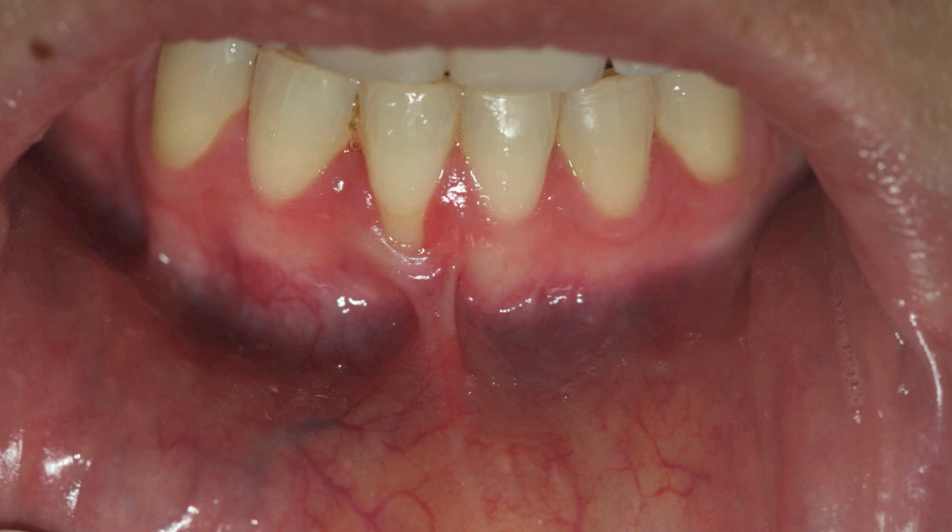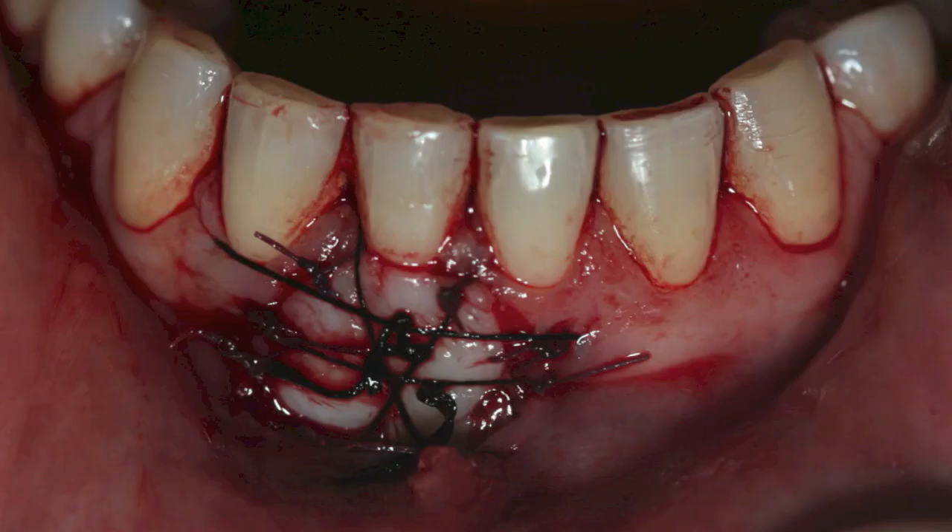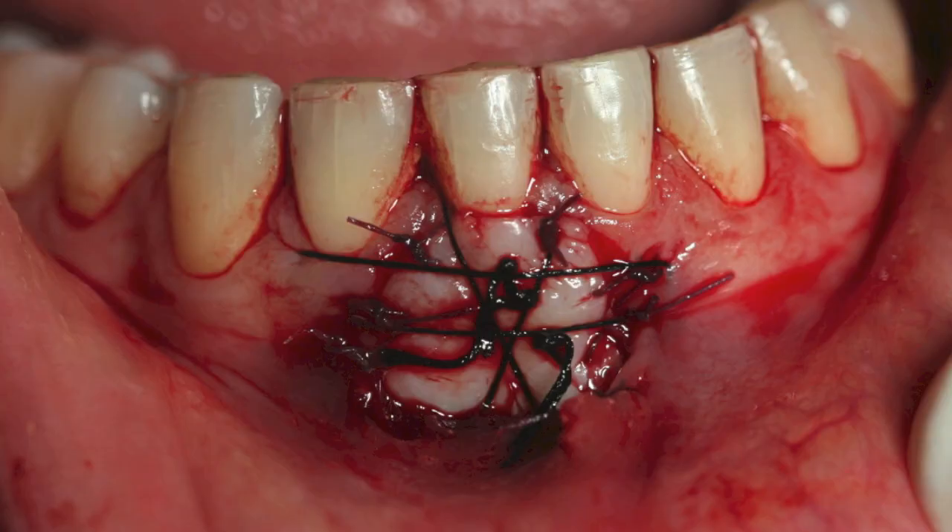Our treatment of choice is to do a split thickness flap, remove the frenum, and apply a free gingival graft in the area. It is very important to stabilize the free gingival graft very well so that there is no mobility of the graft upon movement of the lip.